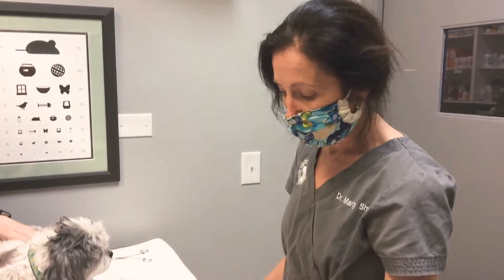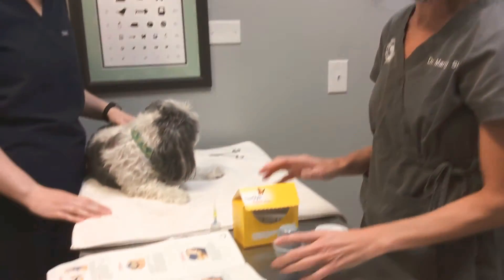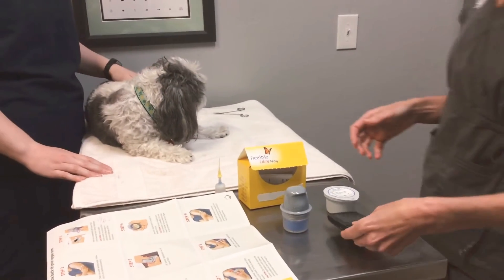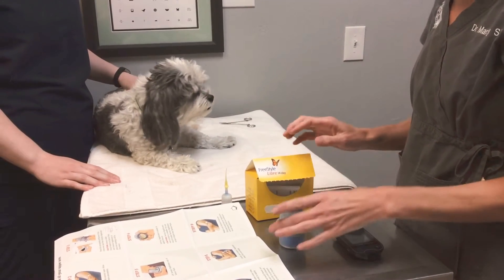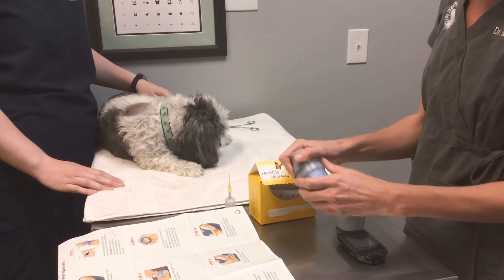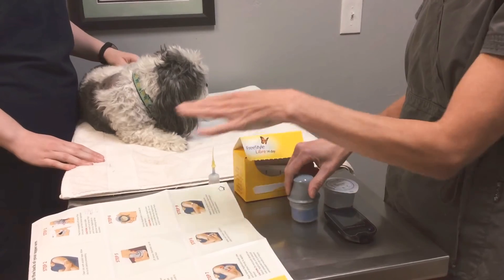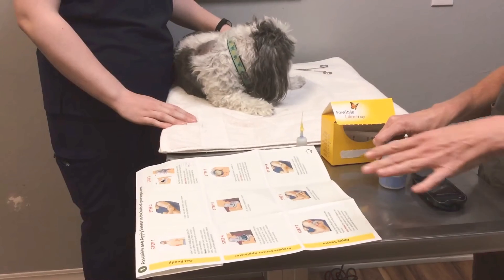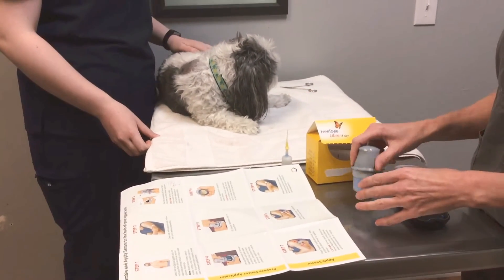Today I'm going to go over how to place a Freestyle Libre glucometer. This is a 14-day glucometer that also has a sensor that can read the glucose measurements for a pet regularly. This is Ali — he volunteered for our insulin injections and now he's here for the glucometer placement. The product does contain a step-by-step instruction guide that you can follow, but since it's designed for people, we'll modify it a little bit for animals.